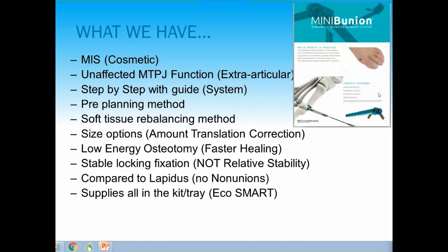I think one question I tried to answer is what surgeons are concerned about: is the bone going to heal, because it's a lot of translation. Hopefully given the x-rays I showed you, you could be confident that it will heal, although it is definitely a bit of a leap of faith at first because you're not seeing, a month after surgery, callus formation or that assurance where you can say, okay, it's time to get out of the surgical shoe and back into your sneaker or loafer.